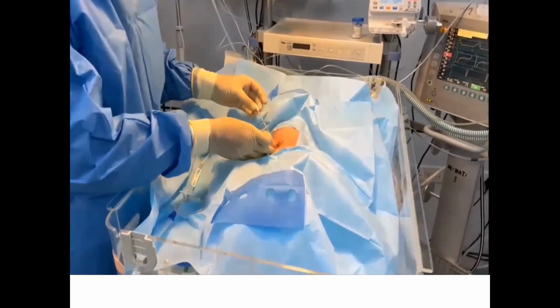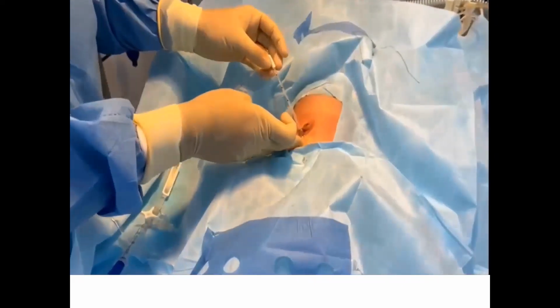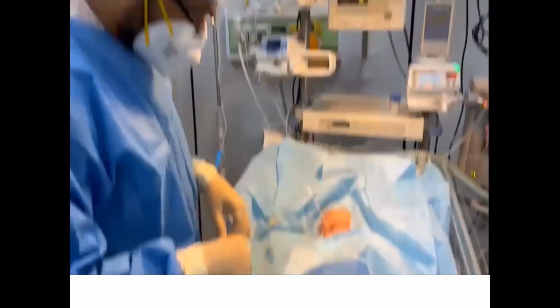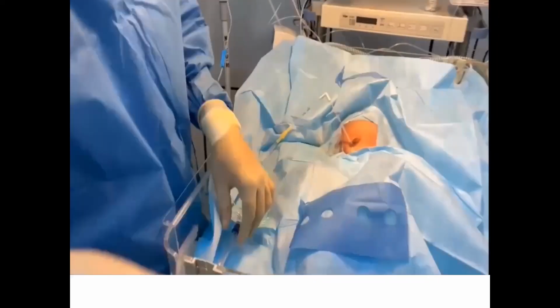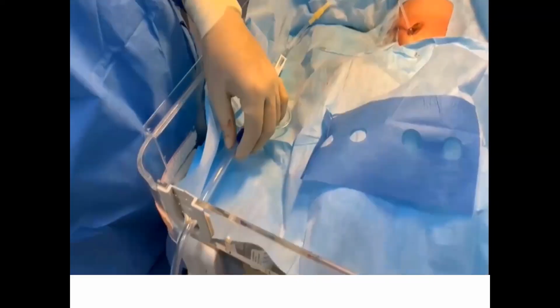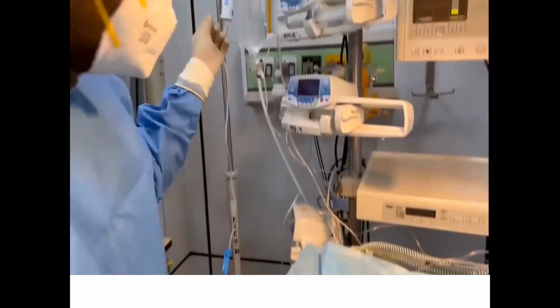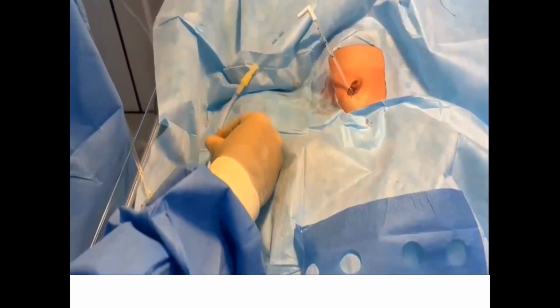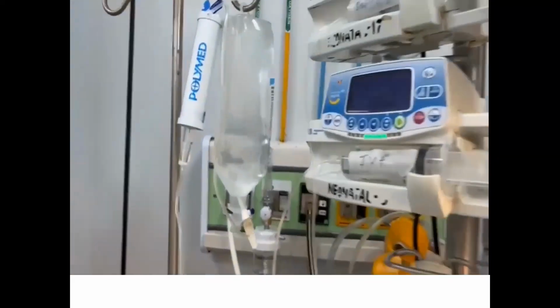So the outflow track consists of the PD catheter, triway and the urobag, and the inflow track consists of the pediatric burette and the drip set and the other port of the triway. Now we will proceed for the first cycle of peritoneal dialysis.